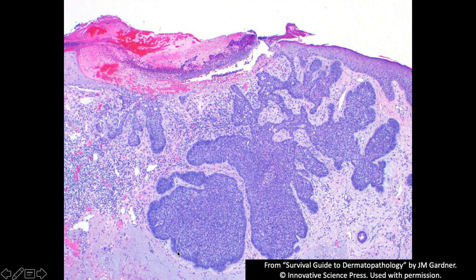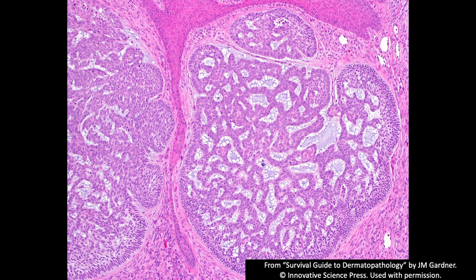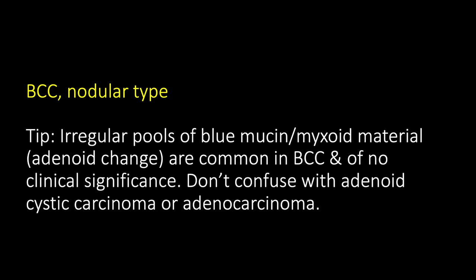Here's another example that looks great for BCC, but notice these big blue pools of mucin — in dermatology they say mucin, in pathology we often say myxoid; I use those interchangeably. These blue pools of regular size and shape in the middle of an otherwise normal basal cell carcinoma are a totally normal, common finding. Here's another example with irregular size and shape of the pools, nice peripheral palisading, clefting at the edge of the tumor nest, and mucin between the basaloid cells and stroma — classic features of BCC. This is called adenoid change.